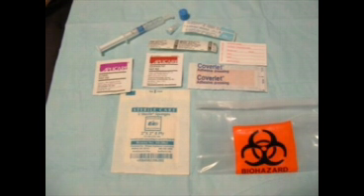Equipment includes a heparinized ABG syringe, 22 and 23 gauge needles, a needle protection device, a filter device, betadine and alcohol prep pads, a gauze pad, ice slush, biohazard bag, label, and bandage.